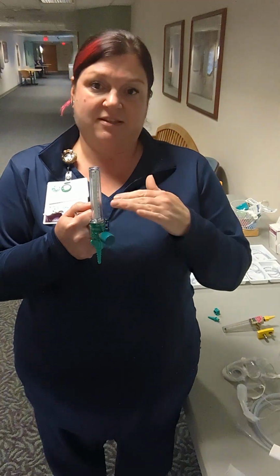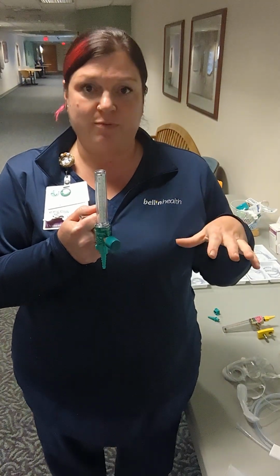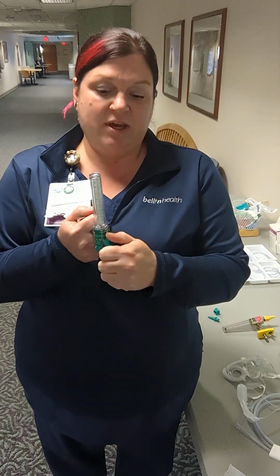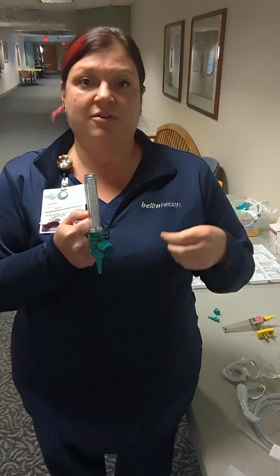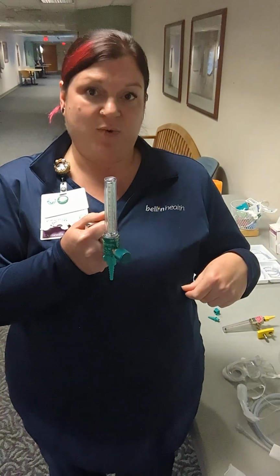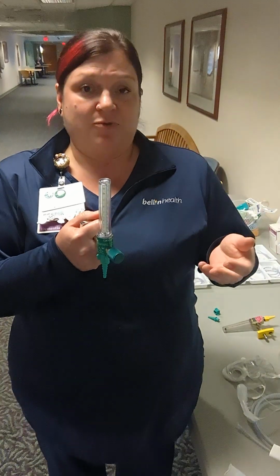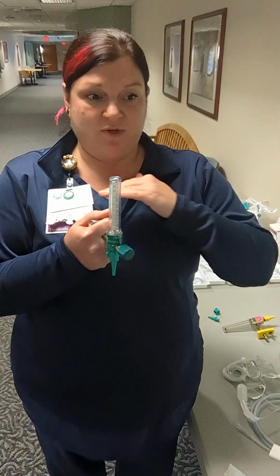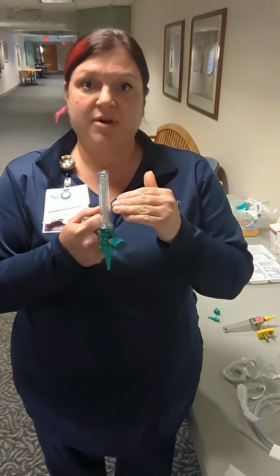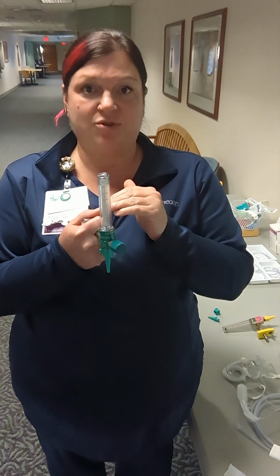So baseline, we're at 21% room air. Every time we increase by a liter of flow, we add another 4% to that 21%. So for example, let's say our patient is on 1 liter of oxygen. We start 21 plus 4, that's 25% FiO2.